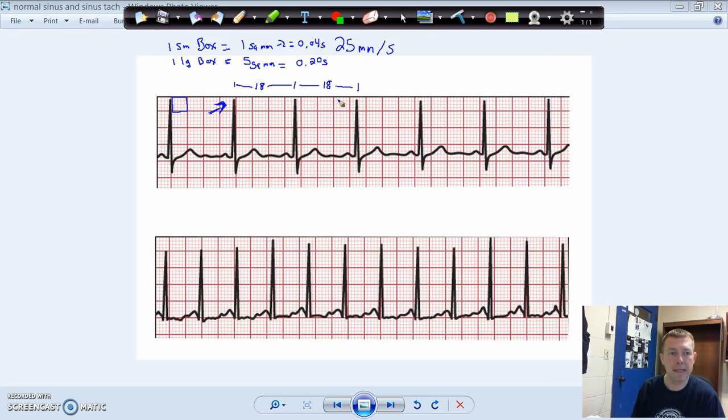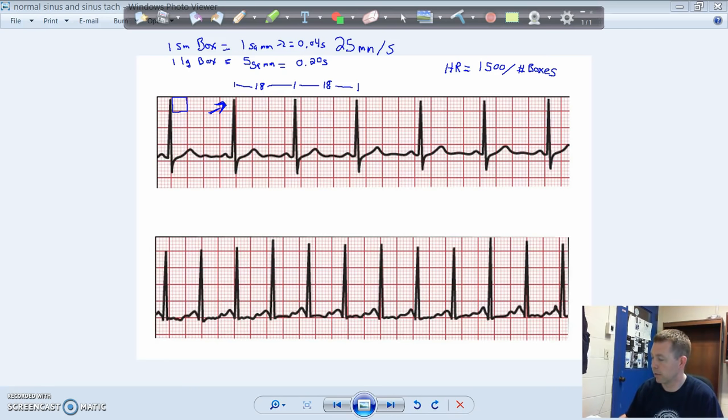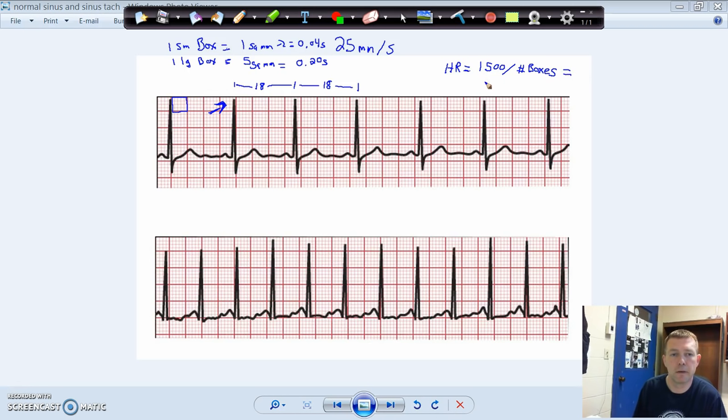Alright, so 18 boxes for each cardiac cycle. Doing all the math, now the computers actually end up doing the math for you. But the easiest way to calculate this out, calculate your heart rate, take 1,500, divide it by the number of boxes. So I'm going to come over here to my computer, 1,500 divided by 18. Heart rate on this guy is going to equal 1,500 divided by 18, which is going to equal 83.3 beats per minute.